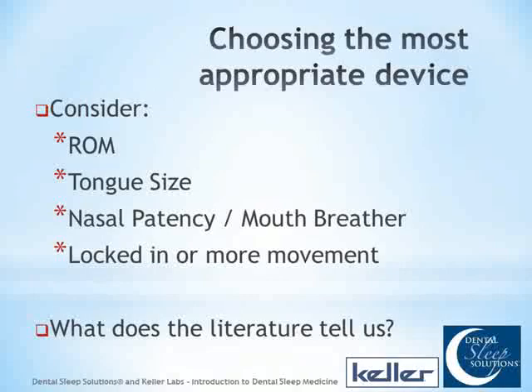What does the literature tell us, Rich? Not much. There are to date, I believe, about a dozen studies that compare one device to another. And the bottom line is that nothing has come out as being perfect. I think your example of the car is very appropriate. If you want this type of car for this type of driving, we just have to make devices. As dentists, you have to jump in and you have to do this. You have to do your homework.